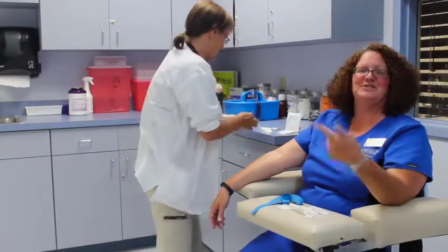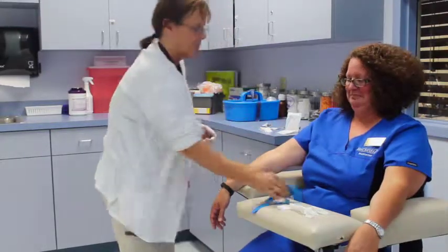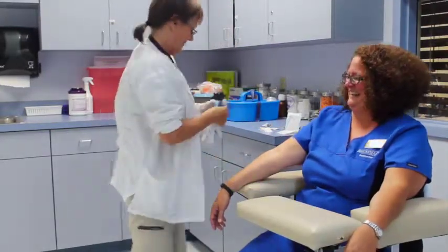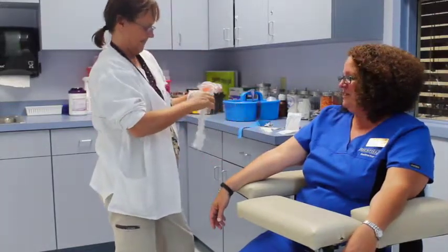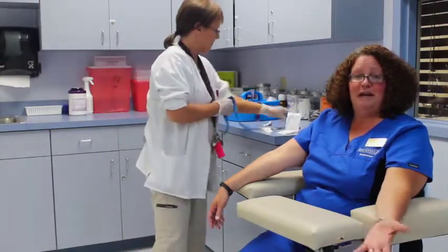First thing we're going to do is clean the arm — she's going to do it herself. One of the things that as a medical assistant you would learn how to do and be checked off on is a phlebotomy draw, where you're going to draw blood for patients.